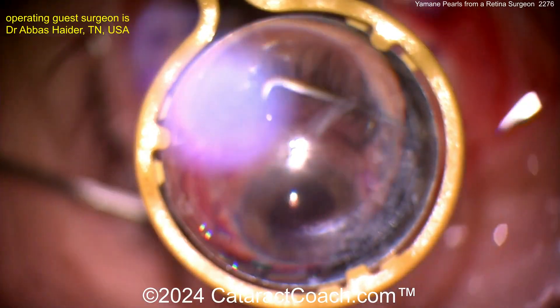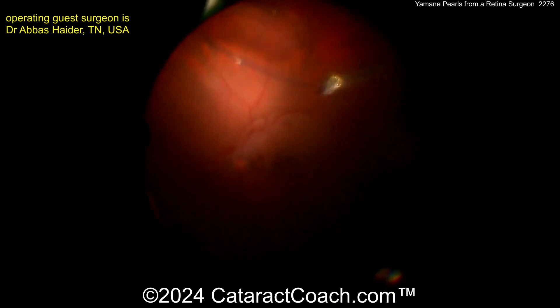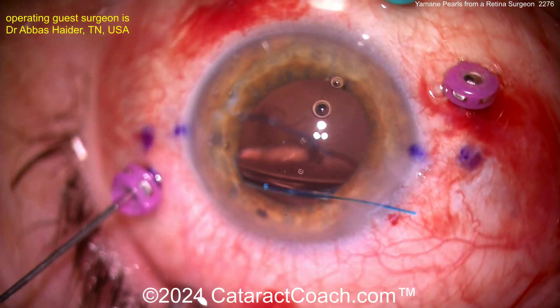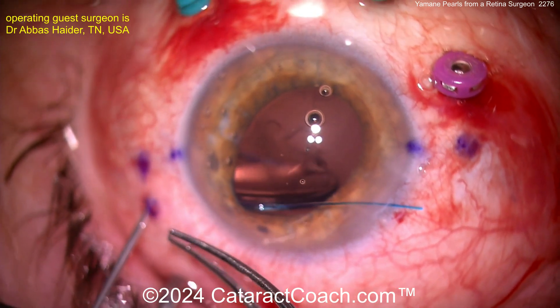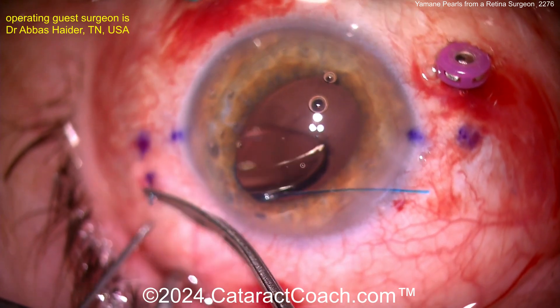Now looking with the retina viewing system — there's the other haptic in the mid vitreous. He can just go ahead and grab that haptic in the mid vitreous cavity. There is no vitreous in this eye; a complete pars plana vitrectomy has been done. He can externalize it, and at the same time pull out that trocar — and that haptic then comes out pretty nicely. Now we'll do the other side as well.